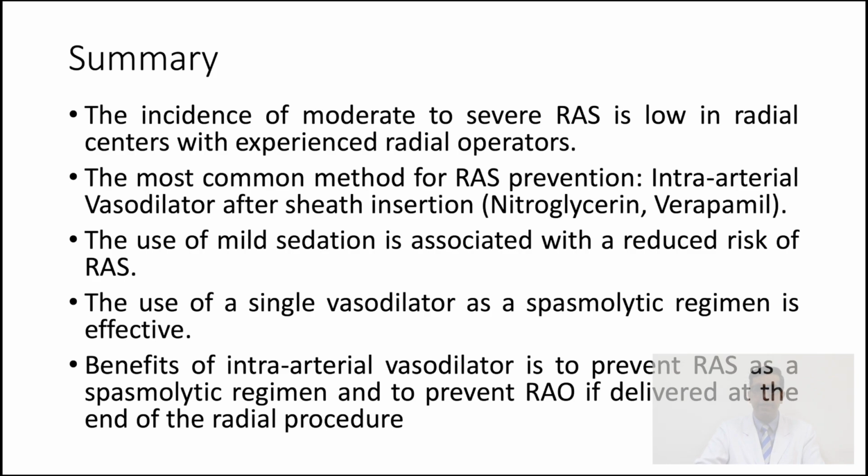And the benefit of an intra-arterial vasodilator is to prevent radial artery spasm as a spasmolytic regimen, and to prevent radial artery occlusion if it is delivered at the end of the radial procedure.